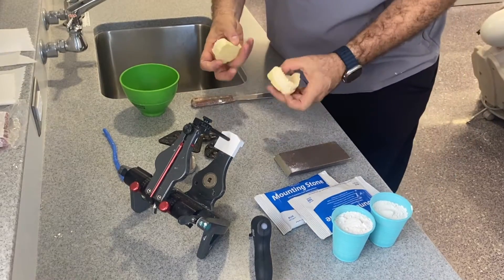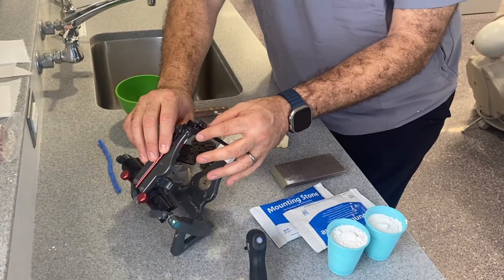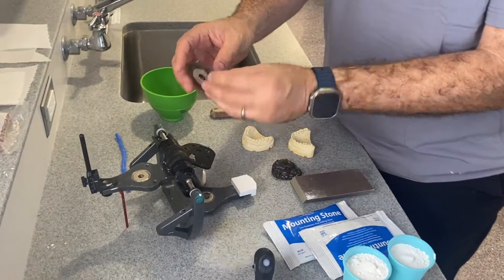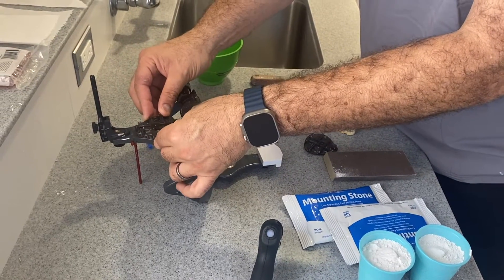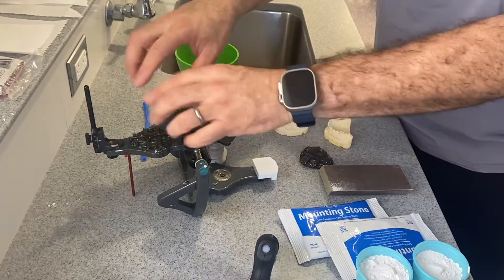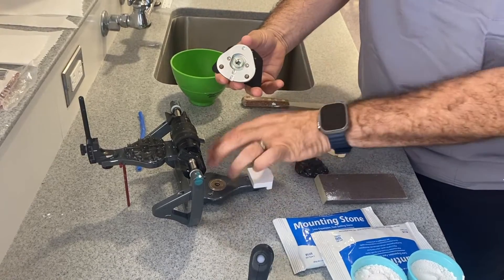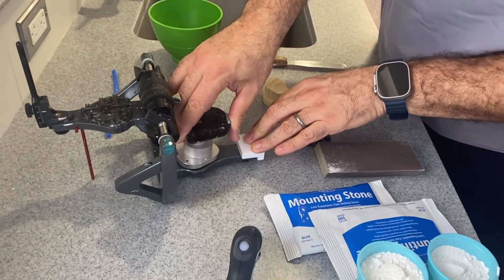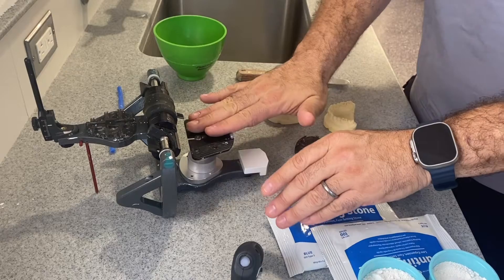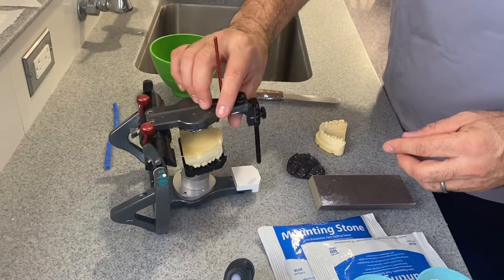The first thing we want to do is make sure we mount this upper cast in the right position, making sure the articulator is at zero. Place a mounting plate in there and make sure it's nice and flush — not crooked anywhere. My mounting stand needs to have both ends fit and the magnet right there. Make sure it fits nice and correct. Once we have that, this is going to give me the position of the upper cast onto the articulator.